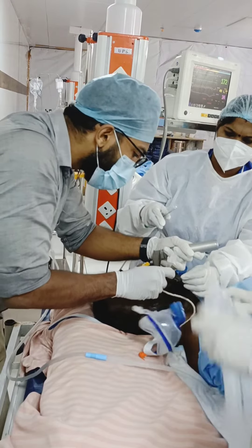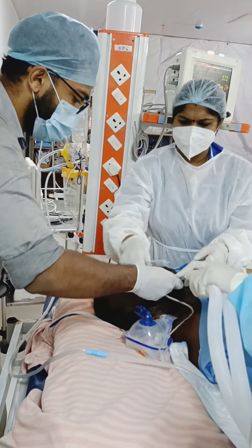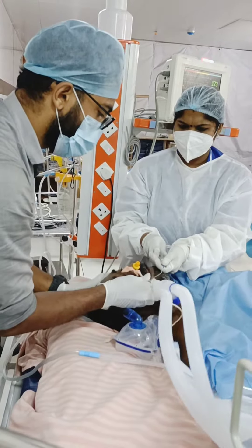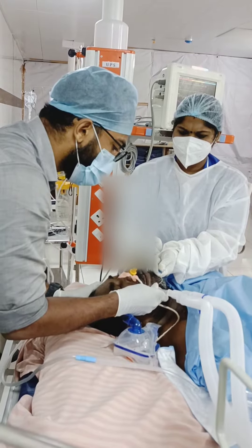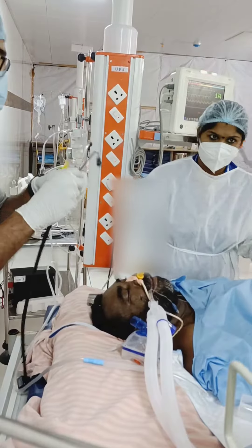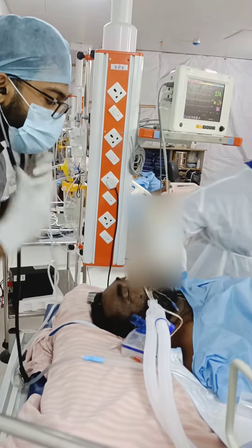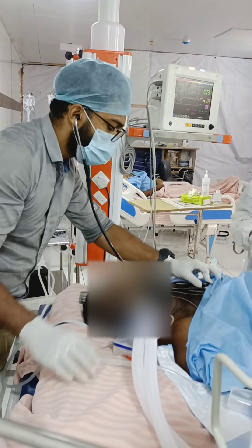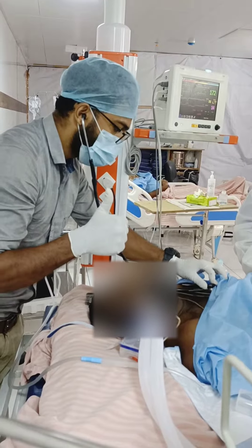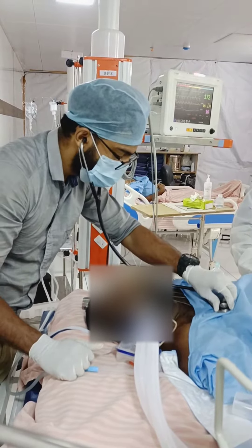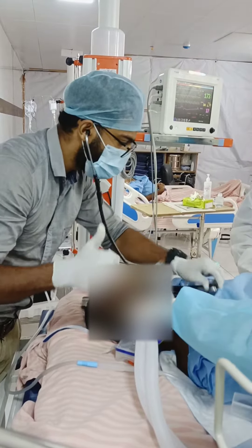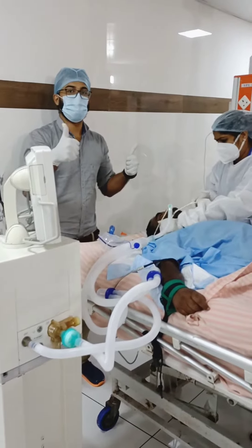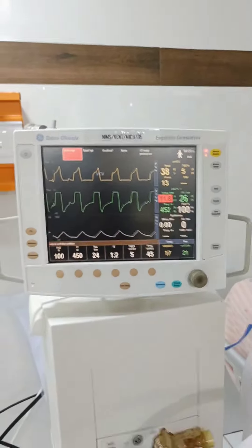Then you connect the tube to the ventilator and inflate the cuff of the ET tube with air. We need to check the air entry to confirm it is equal on both lungs. You can also use a capnograph if you have one — it shows a spike on the monitor as carbon dioxide is expired.